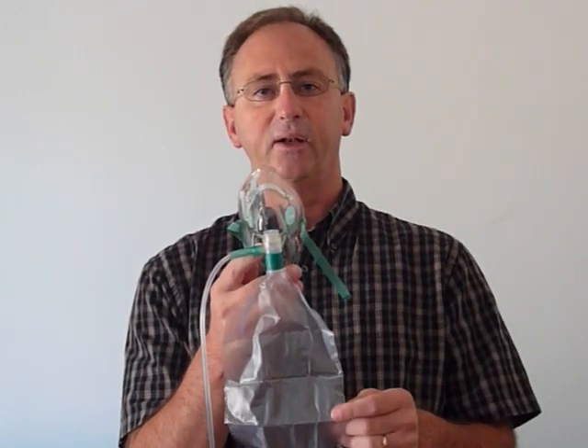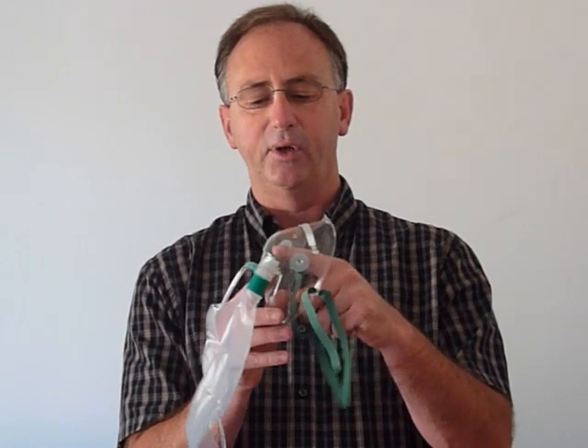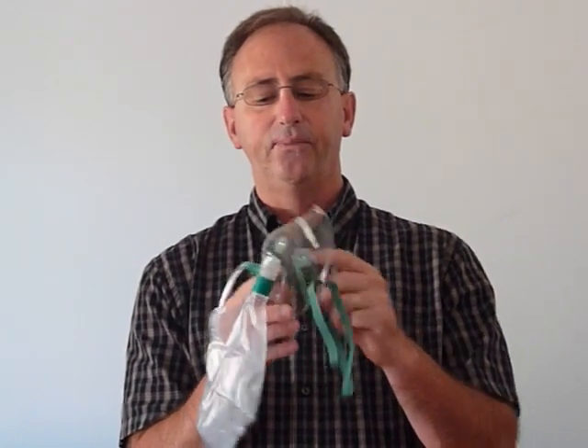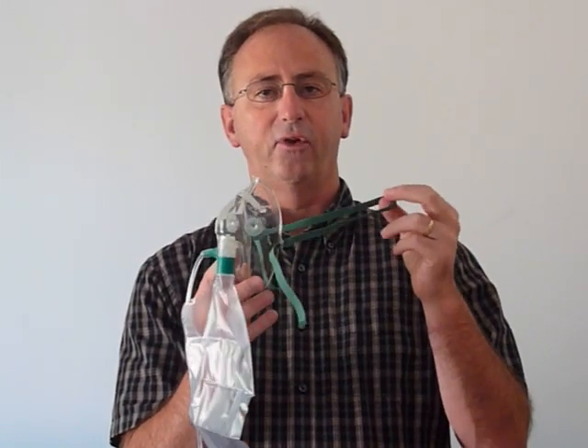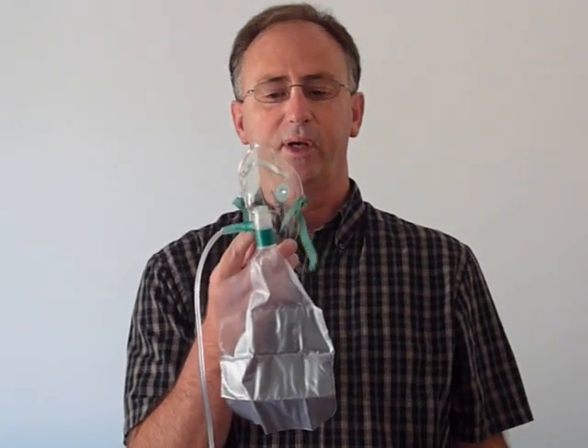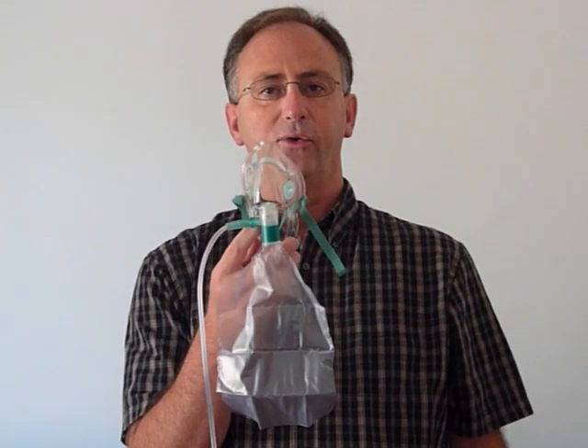You set your oxygen flow from 10 to 15 liters per minute, fill up the oxygen bag by simply holding down the valve till the bag is full, then place the oxygen mask on the patient's face and put the strap to hold it in place. That's our adult total non-rebreather.